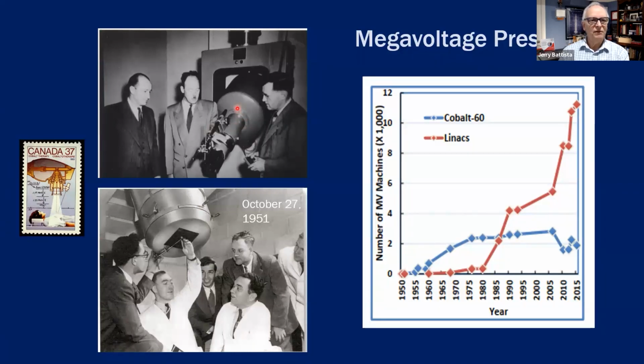But he developed these machines in Western Canada. However, the commercial machine, this machine here, called the Eldorado A, was implemented in London, Ontario, right here. And the first patient to be treated, first cancer patient to be treated, that happened in October 1951. In a sense, this was the birth of megavoltage, because before that time, the machines, betatrons, or use of radium was really quite limited and unstable. But cobalt provided a stable megavoltage source.